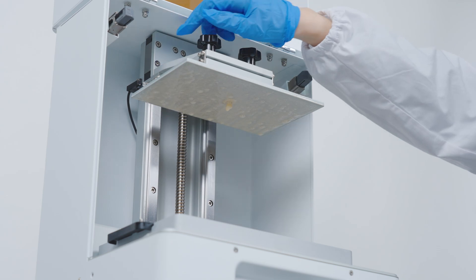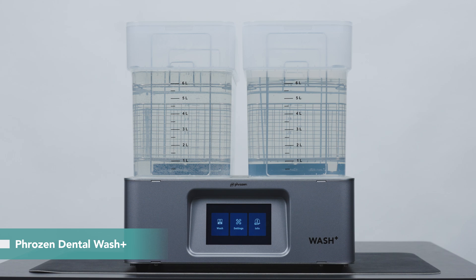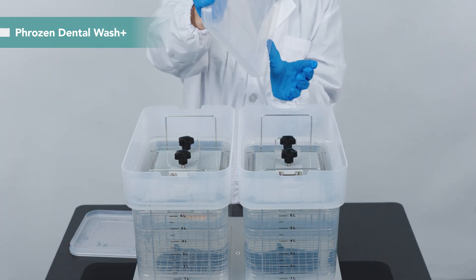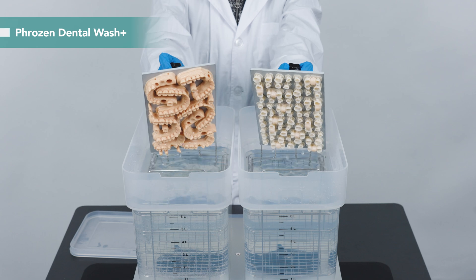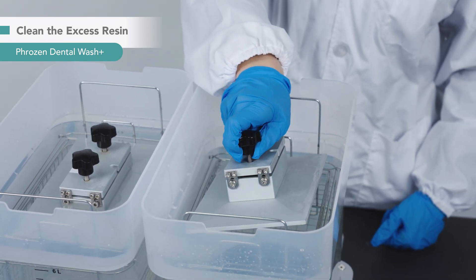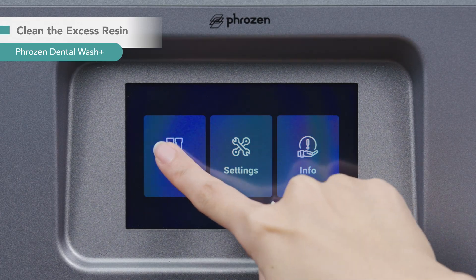After 29 minutes, the print is complete. We are going to wash the crown with Frozen Dental Wash Plus. Equipped with a versatile dual tank system, it is designed for dental professionals to fulfill various washing requirements. You can set it to double your wash output or finish two different washing requirements at the same time — for example, washing the removable die model and the crown in a single cleaning cycle. Place the building plate directly into the tank and set the wash time for 5 minutes.